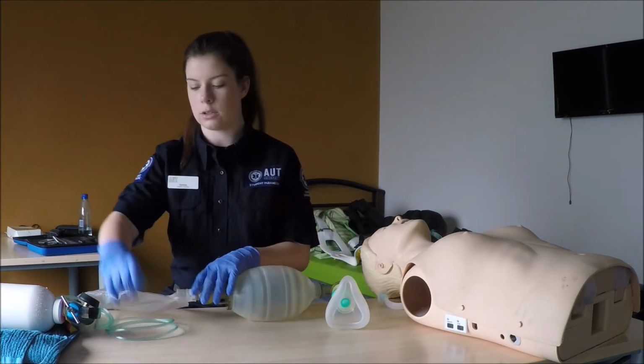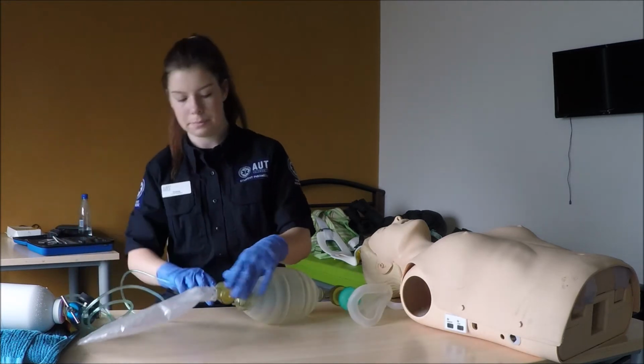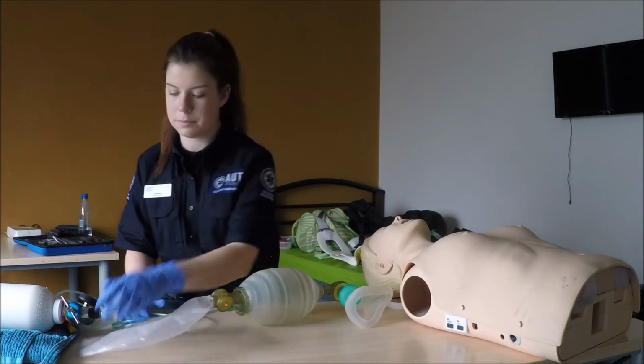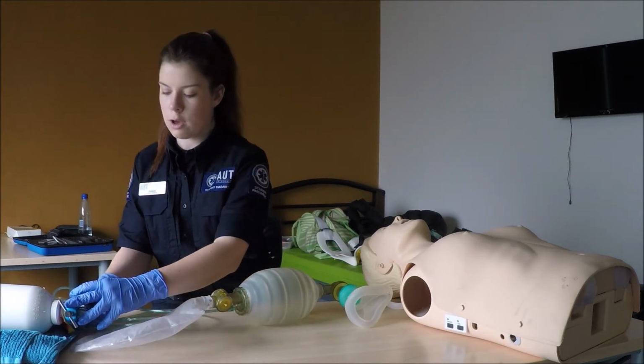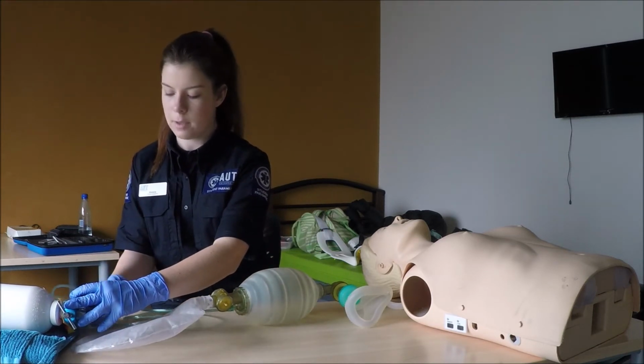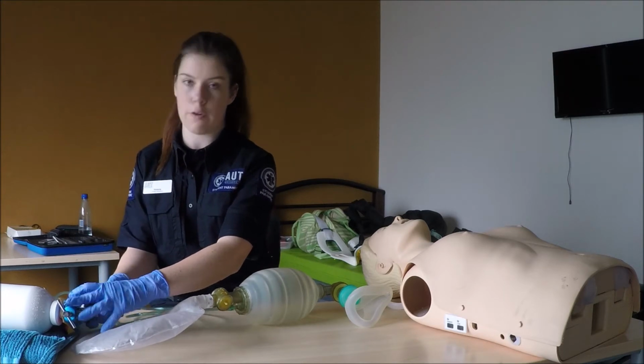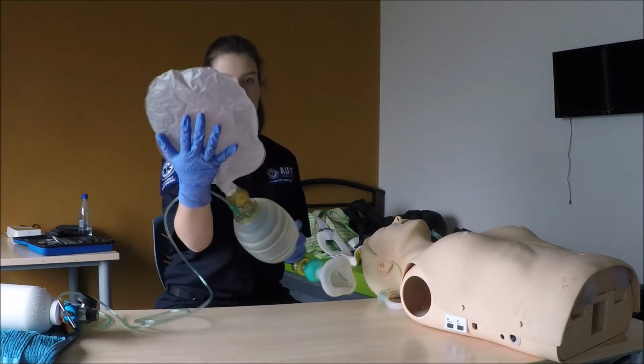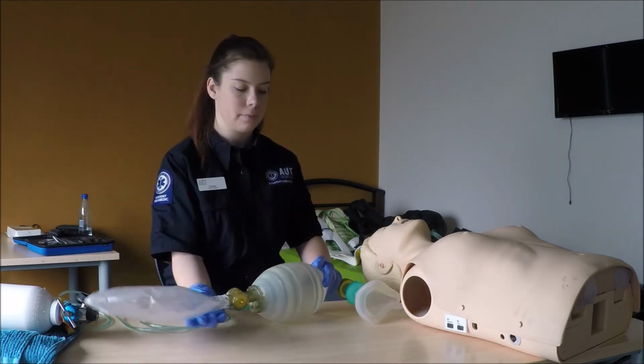We'll now attach the oxygen tubing to our bag and turn on our oxygen. So we'll turn the oxygen on to a flow rate of 15. For a bag valve mask, we use a flow rate of 10 to 15, but starting off at 15 to ensure that the reservoir bag is inflating, which it is.